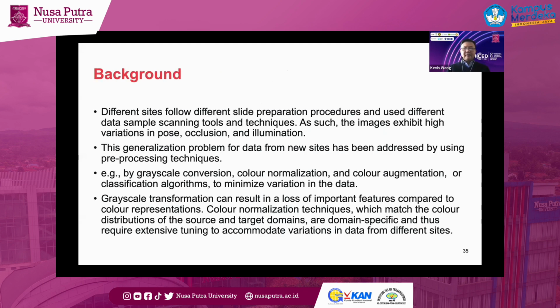What is transfer learning? If you still remember why we want to use the WSI, it is because the WSI is used to generate the digital image, and of course, in order to generate the digital image, you have to go through the scanner.